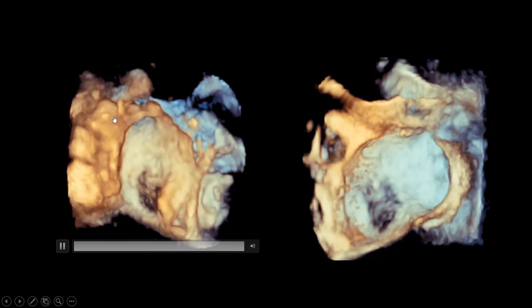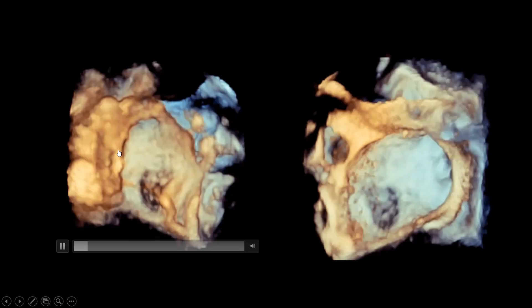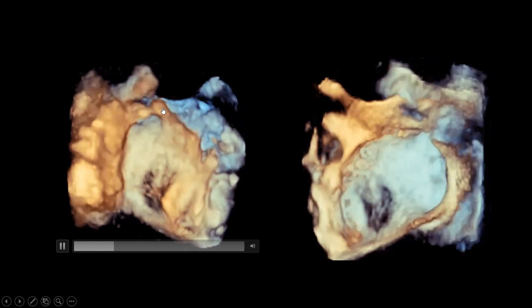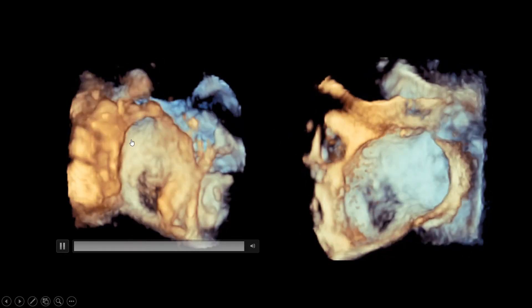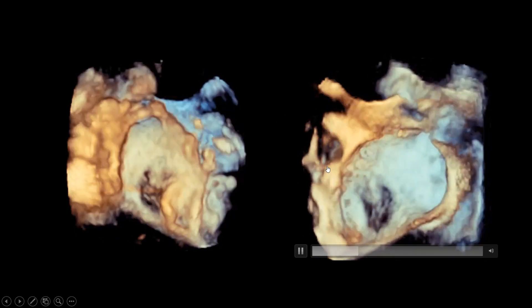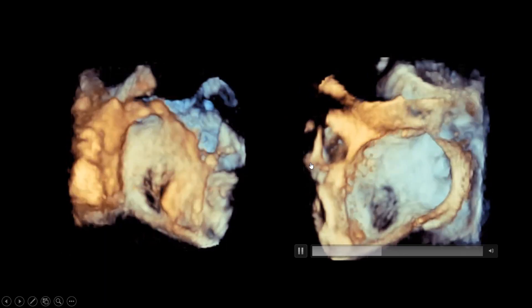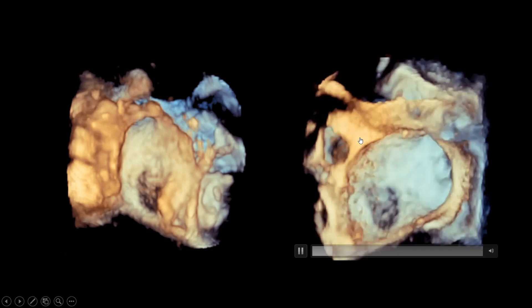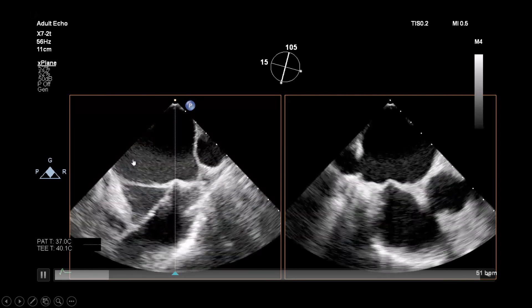Assessment of the 3D interatrial septum: this is the whole interatrial septum from the right atrial aspect using the retro-aortic maneuver. You can see the superior vena cava opening, the IVC, the coronary sinus, the aortic valve, and the aortic root. The faint part is the fossa ovalis. Flipping that over 180 degrees shows you the septum from the left atrial aspect, with the fossa and the openings of the pulmonary veins.